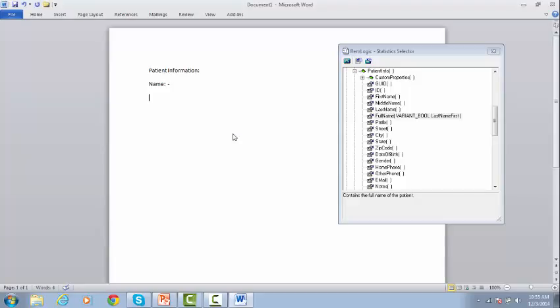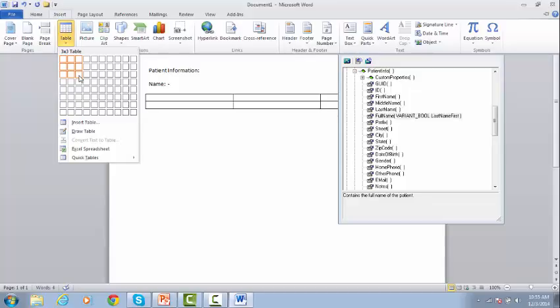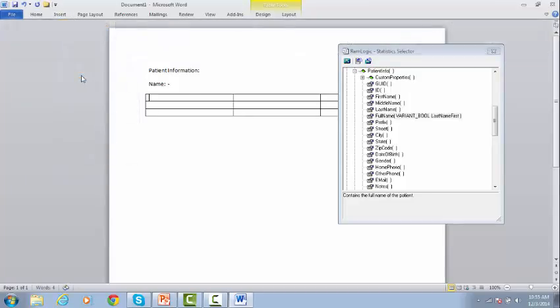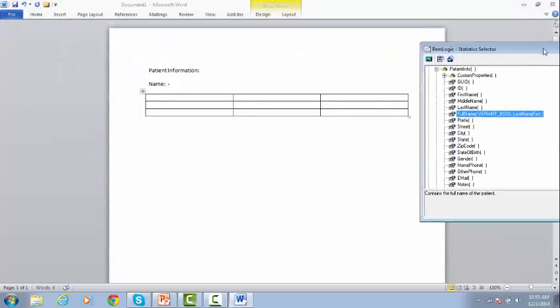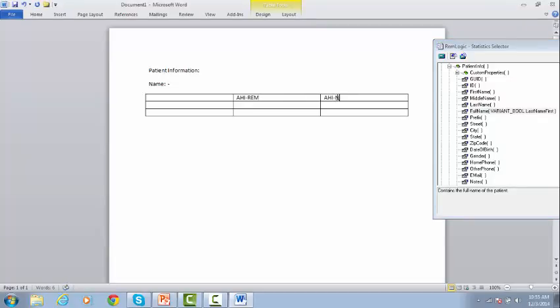If you want to report the Apnea Hypopnea indices in relation to sleep stages, and also in relation to body position, create a table. Type in the required text. Here, we type AHI in NREM. Here we put Supine. And here we enter Non-Supine.